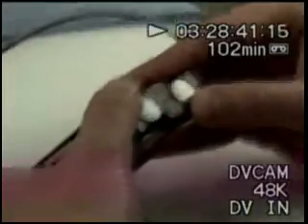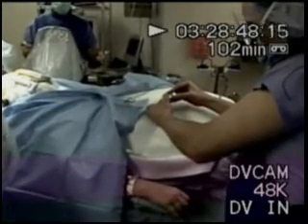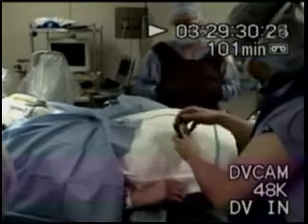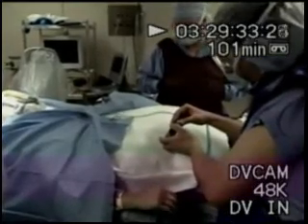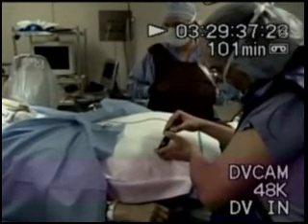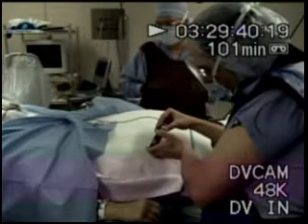This is another reason why the patient is awake. You see in my hands the stimulator. And you can see that as I turn it on, the tremor stops. I turn it off again — the hands start shaking again. I turn it on one more time — the tremor stops again. That is only possible if the patient is awake. And that also tells me about side effects — I am getting a very good idea of what kind of side effects the patient will have once the surgery is done.